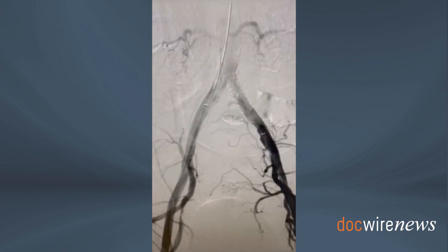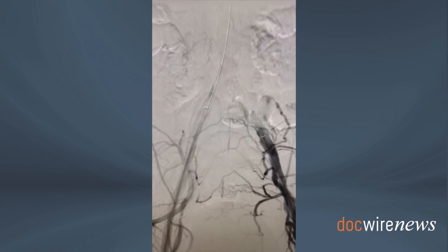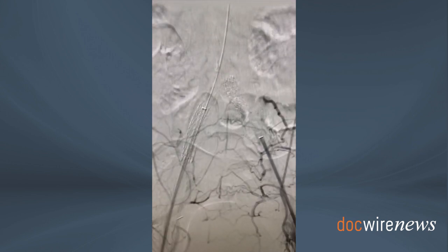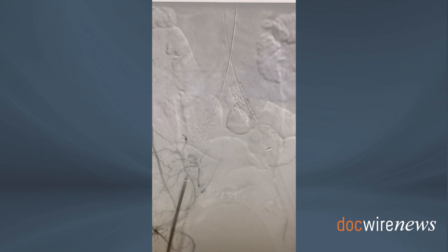Following angiography was surprising. At this point, we noticed that the stent in the right common iliac artery has migrated and has covered the right internal iliac artery partially. And the ostium, or the proximal segment of the right common iliac artery, is now without any stents.